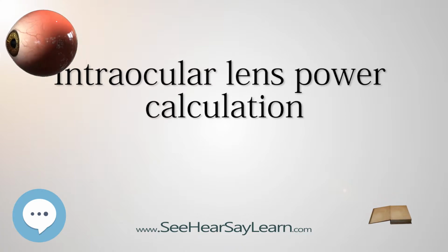Partial coherence interferometry. The technique of partial coherence interferometry measures the time required for infrared light to travel to the retina. Because light travels at too high a speed to be measured directly, light interference methodology is used to determine the transit time and thus the AL. This technique does not require contact with the globe, so corneal compression artifacts are eliminated. Compared with ultrasonography, the partial coherence interferometry provides more accurate, reproducible AL measurement.